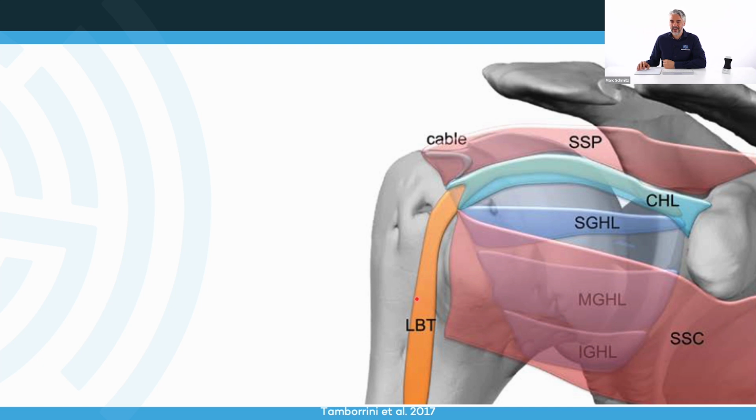After we've seen the biceps distally, we're going to follow the long head of the biceps back to proximal, and then we're going to try to find the biceps in the rotator interval. Two years ago, I did a webinar also with Clarius, also a little bit about the rotator interval, and this webinar might be available on clarius.com. So you want to check that out.